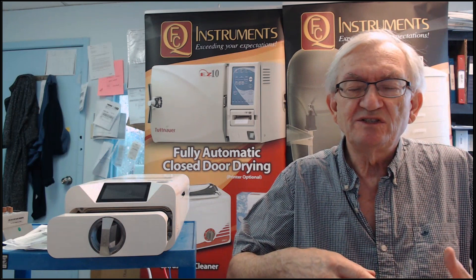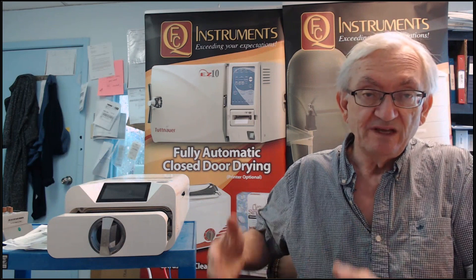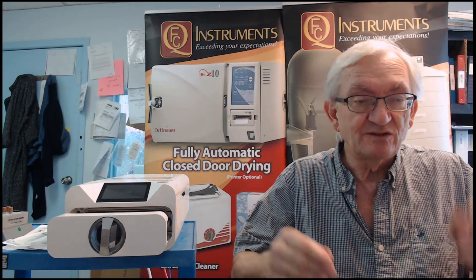The two things that jump right out at you are the speed of the autoclave, the size of the autoclave being easy to carry and manage, and the price point being attractive. It sells for less than $4,000 Canadian including shipping.